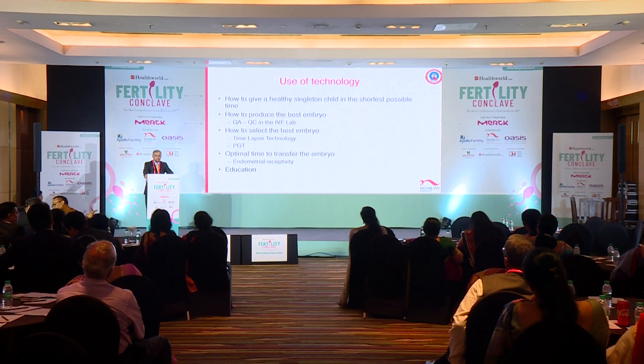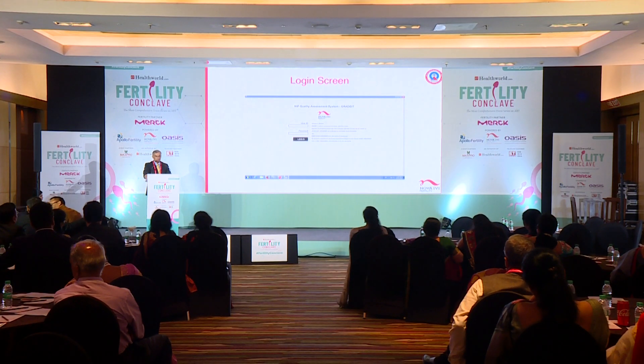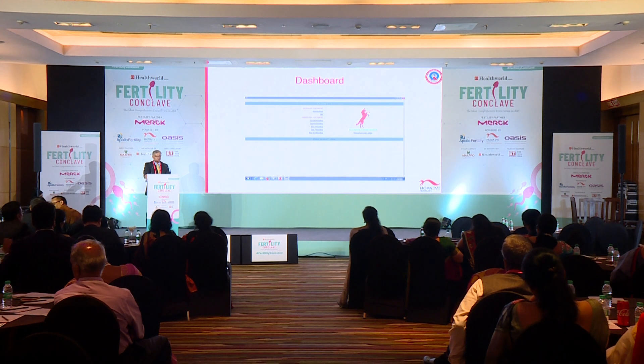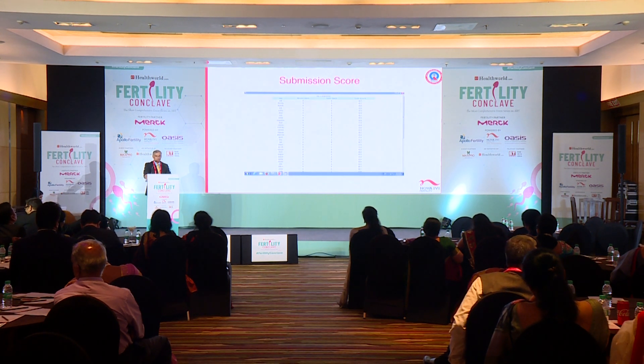Lastly is the use of technology in education. As we grow and have more clinics, how do we monitor and educate our embryologists? An application can be used to see how embryologists are scoring. You can provide online images of embryos and ask the embryologist to grade or assess them. This becomes a very important teaching tool as part of a distance learning protocol when you have multiple people working at multiple locations, allowing you to see how well they are up to the task.